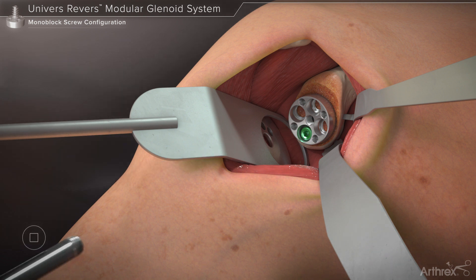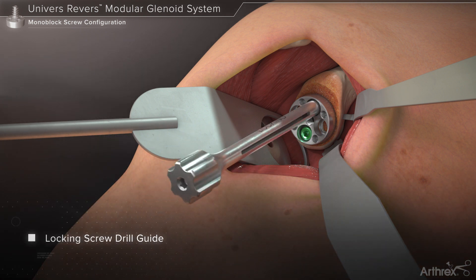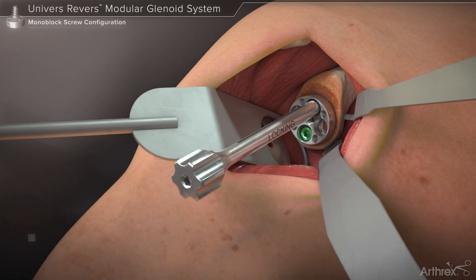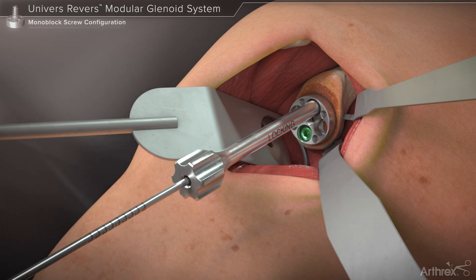For locking screws, thread the locking screw drill guide into the selected base plate hole. Note that on standard base plates, the orientation of the locking screws will be 10 degrees divergent from the central screw axis. The 3 mm drill is again used, followed by the hex driver to seat the screw.